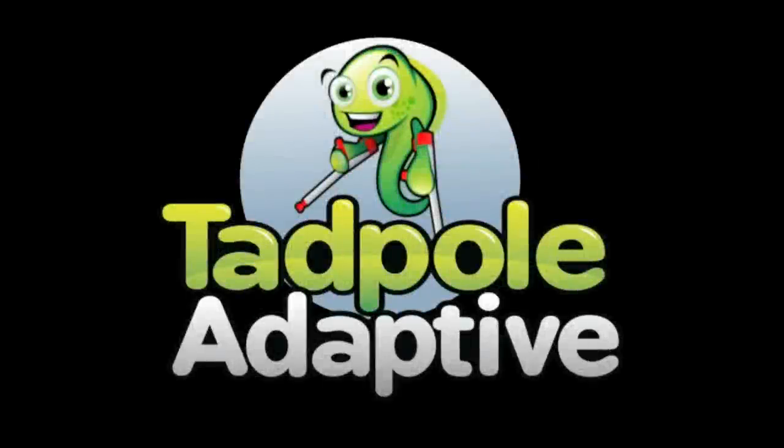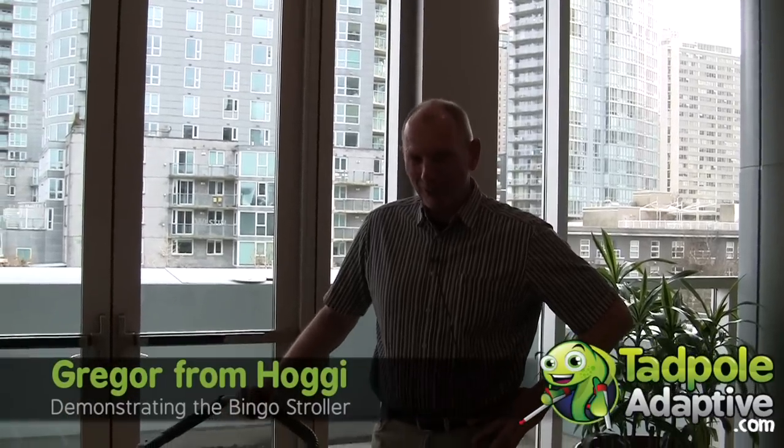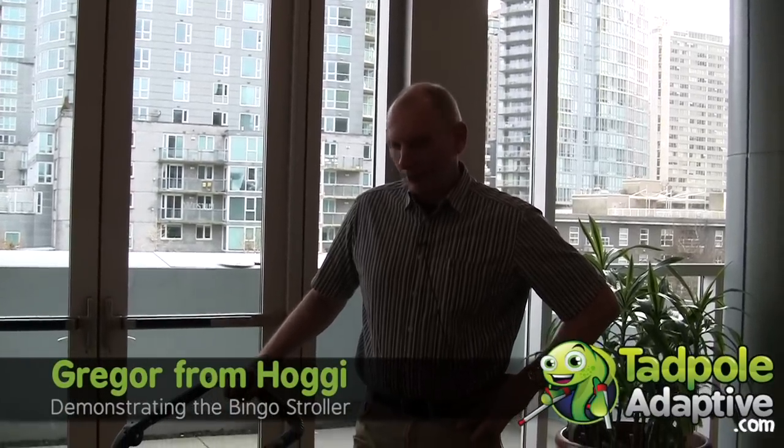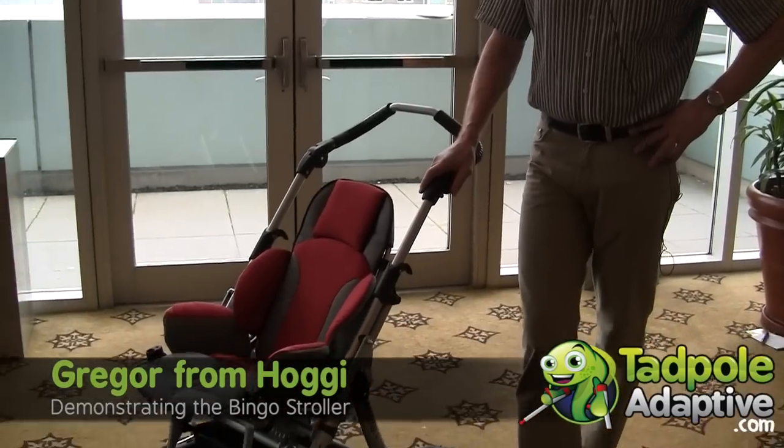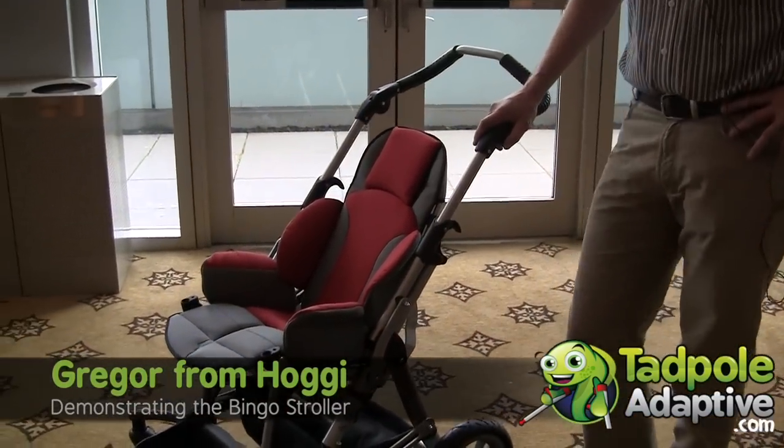The following is a Tadpole Adaptive production. My name is Gregor Horacek. I'm the designer of the Bingo Rehab post chair. This is a post chair for kids with special needs.